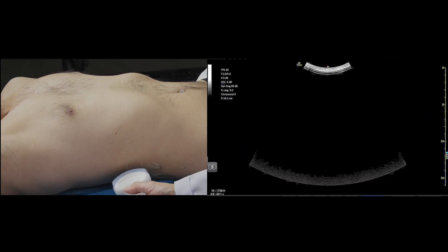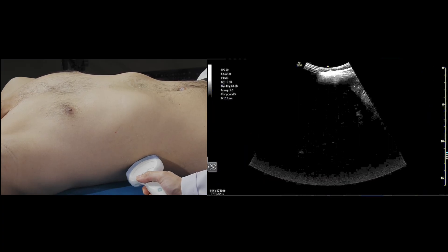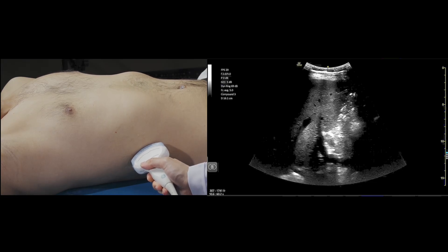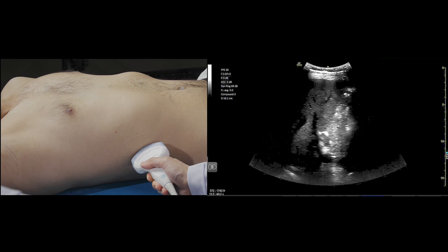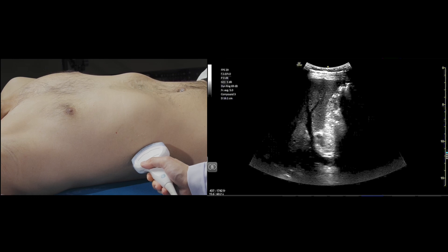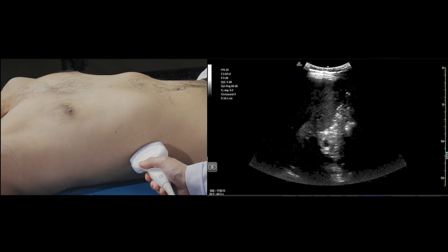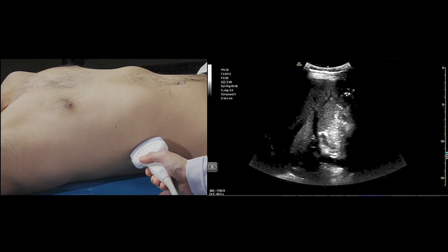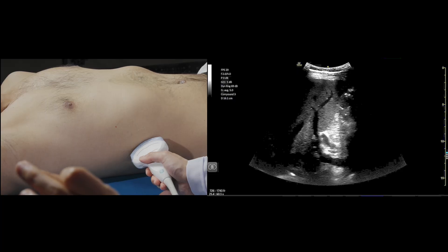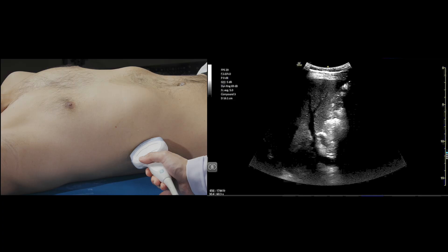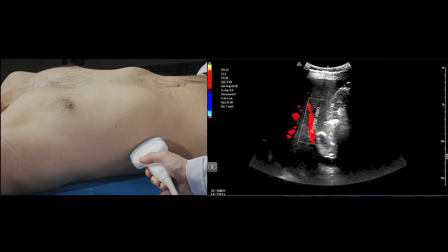Next, we move to the portal vein. We continue by moving the probe slightly in the caudal direction to observe the liver adjacent to the right kidney. We can fan the transducer slightly anteriorly to view the portal vein, and employ color flow to see continuous hepatopetal flow — meaning blood moving towards the probe. The portal vein has a slightly thicker wall than the hepatic vein, and sometimes you can see a brightened wall identifying it as the portal vein.